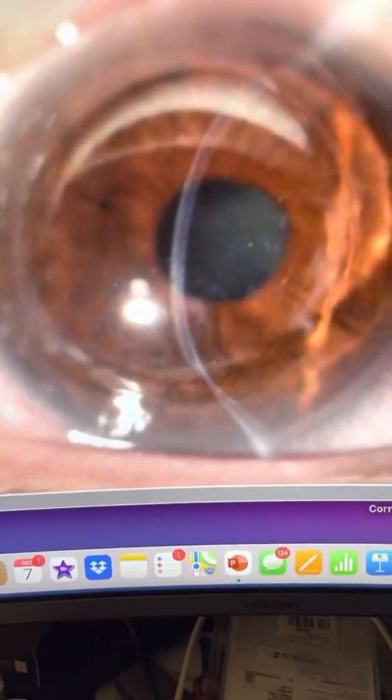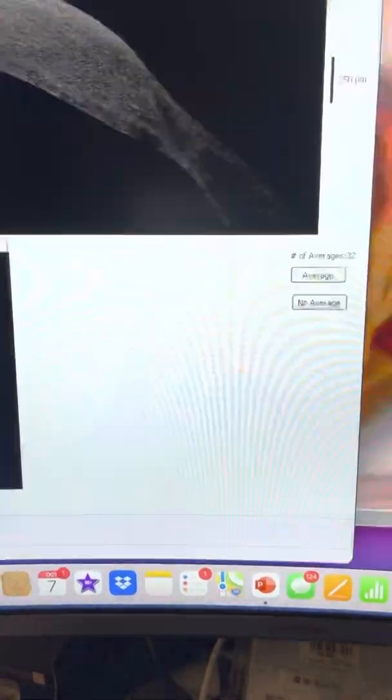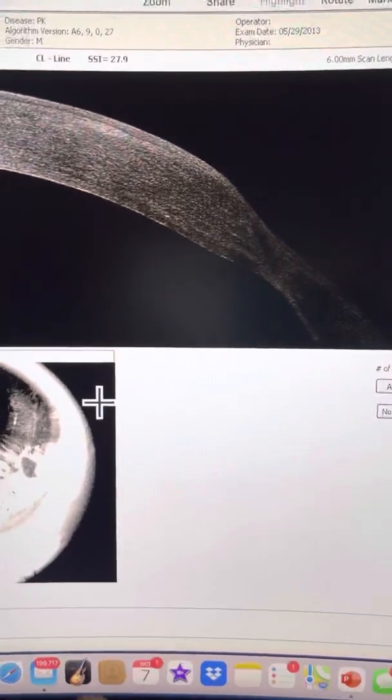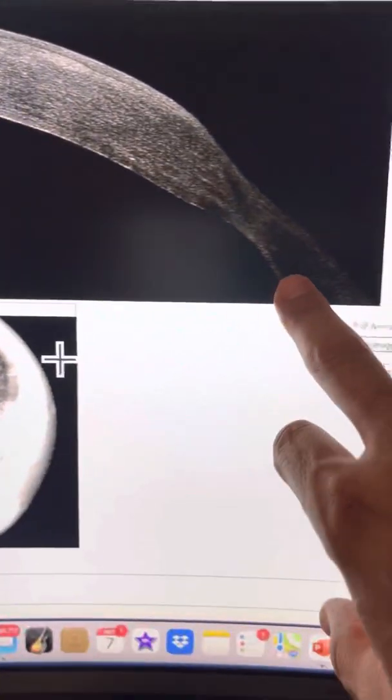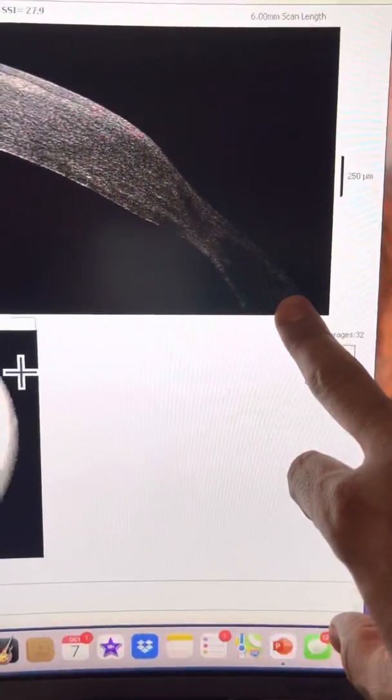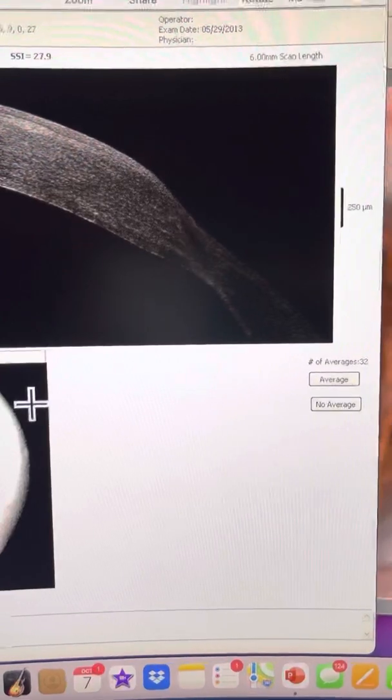The cell counts were pretty good. The cornea is not bad itself. You can see how the slit here thins immensely. This is an OCT slice. You can see it's at the 6 to 5 o'clock position and inferiorly. And you can see this same pathology here very nicely, picked up by the Avanti Opto-V-OCT.